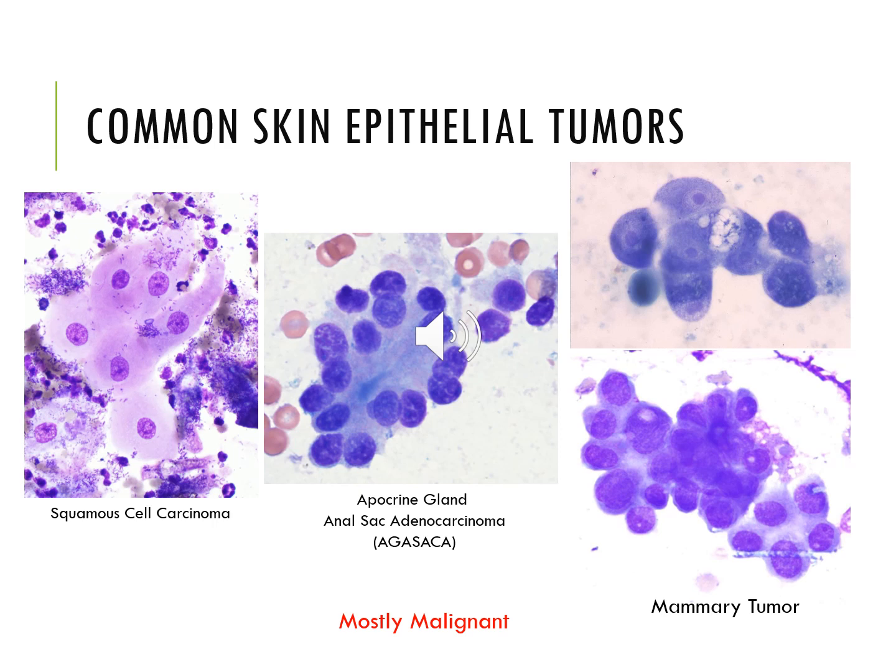So these are some common epithelial tumors, again, of the skin, which unfortunately are much more aggressive. And so the first one on the left, that is an example of squamous cell carcinoma. These are very common in horses and in cats. They have this typical fried egg appearance, people say. So they have small centralized nucleus and then kind of abundant, lightly eosinophilic cytoplasm.